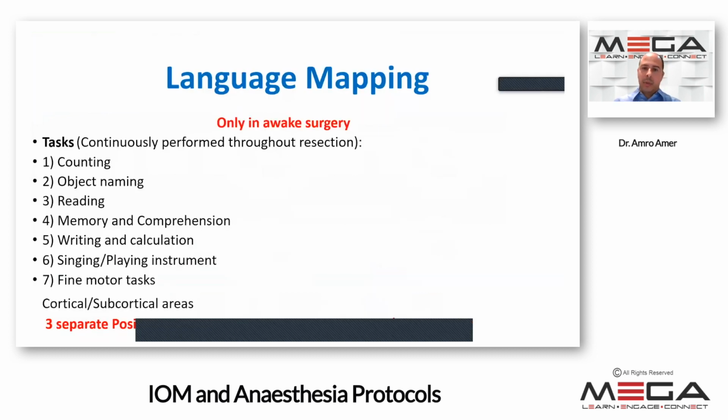That's the benefit of language mapping. We do it awake. If we have what's called speech arrest, once we stimulate and the patient starts stuttering, we stop. Actually, there are different tests for language mapping. Usually there is someone who's doing the test, and I'm with him.